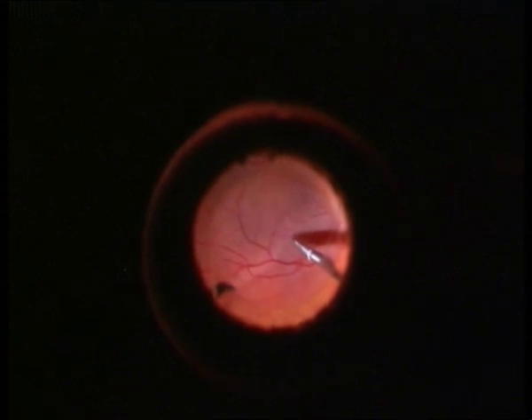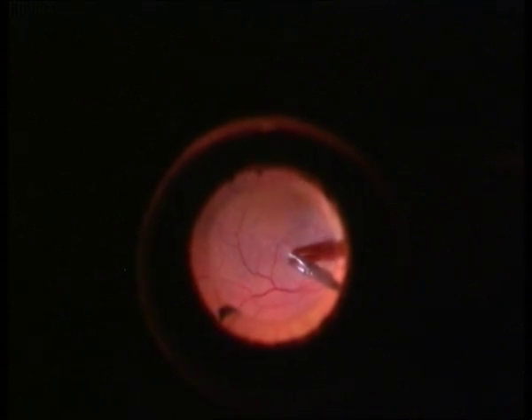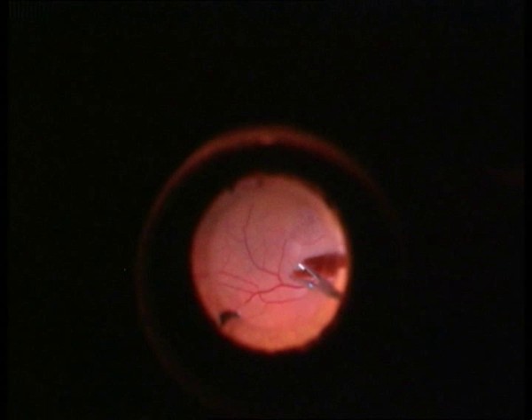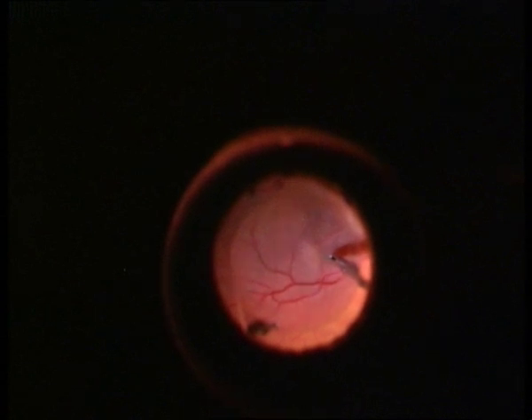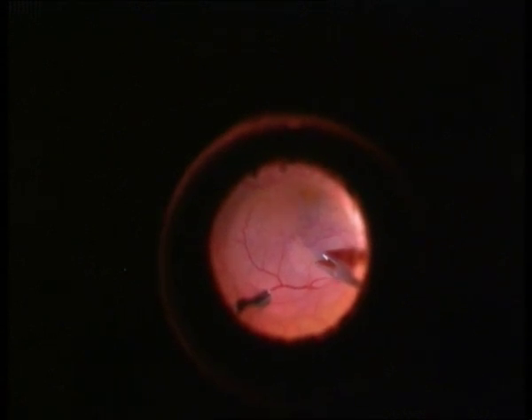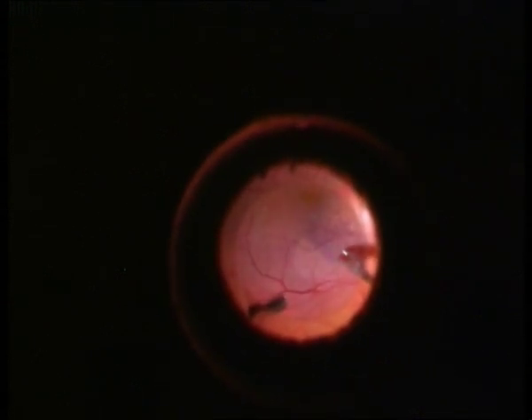Now we have to see how easy it is to create the first flap with the Eckardt gripping pincette for peeling of the ERM in a very easy manner. We have to grip the proximal edge of the flap — the nearest one to the retina.